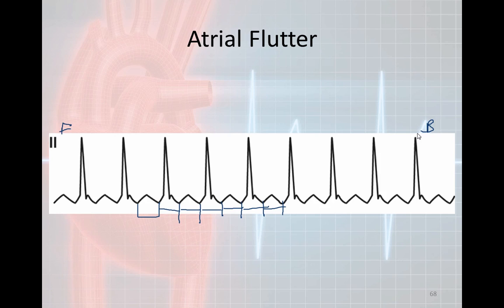If you do that, you can say, yeah, this is more than likely an atrial flutter, and this is consistent. You draw the lines through the peaks. There's a peak here. There's supposed to be a peak here, but it's buried in the QRS. Supposed to be a peak here, but there is a peak here. You can count 1, 2, QRS, 1, 2, QRS, 1, 2, QRS. So you know that every single one of these is a 2-to-1 conduction. The overall interpretation would be atrial flutter with 2-to-1 conduction.